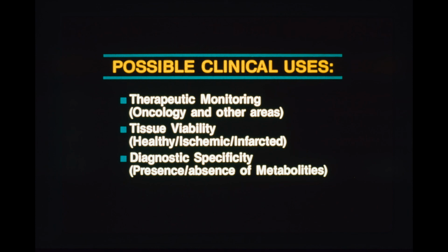Tissue viability, phosphorus spectroscopy looks like this can be very useful. From an imaging standpoint, probably not. If we can collect a spectrum in the matter of a few minutes, whereas a chemical shift image may take on the order of an hour or so, clearly the spectroscopy will be used. And I think the most important thing for NMR in particular is diagnostic specificity. We don't have specificity right now in NMR. This is something which we think ultimately spectroscopy can be used for this.